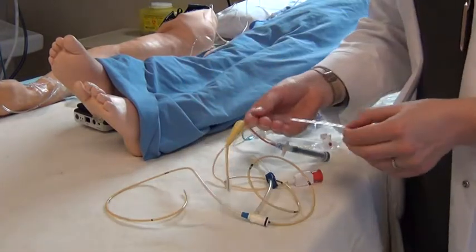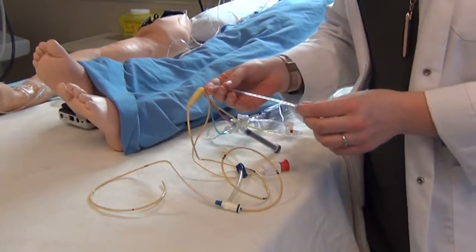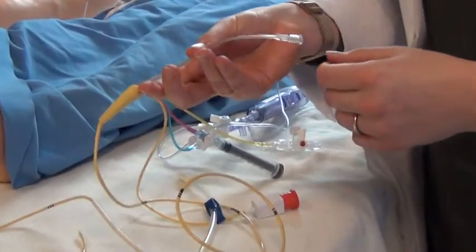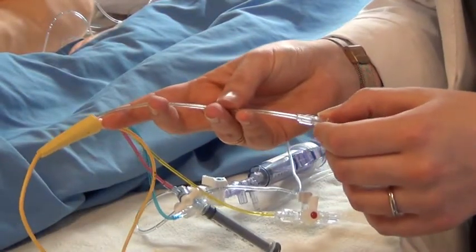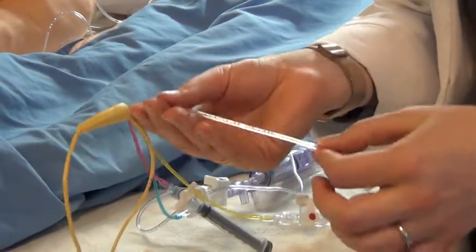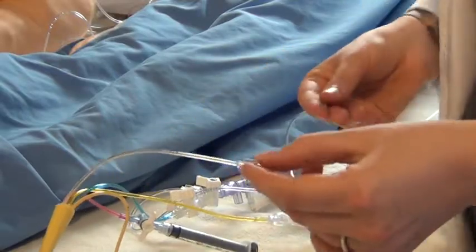There is a fifth lumen called the right atrial proximal lumen. This is used for any type of infusion — for example, a furosemide drip, normal saline, antibiotics, or any IV fluids can be administered through this line.